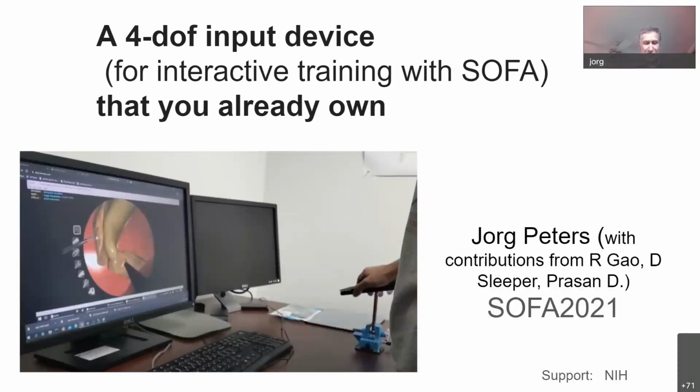So first of all, I'm so thankful to the SOFA community for all the software. I've been a great fan, and we're using it for surgical simulation, same as the previous two speakers who gave fantastic talks here. So I'll give a very short one here. A 4-degree of freedom input device that you already own. This is a cell phone, and this is a pen, well, you may not own this one. This is SOFA running remotely with simulation of laparoscopic surgery, and this will be the laparoscopic surgery input tool.